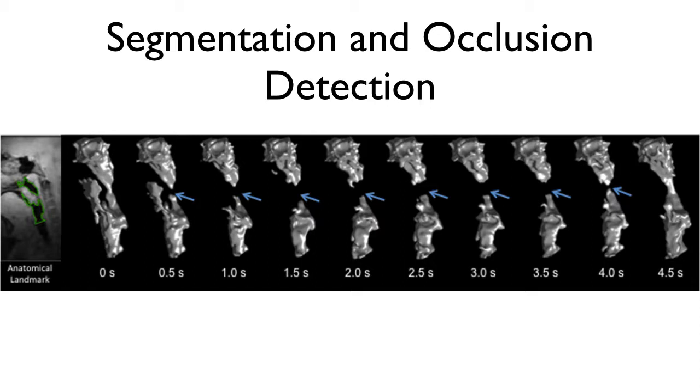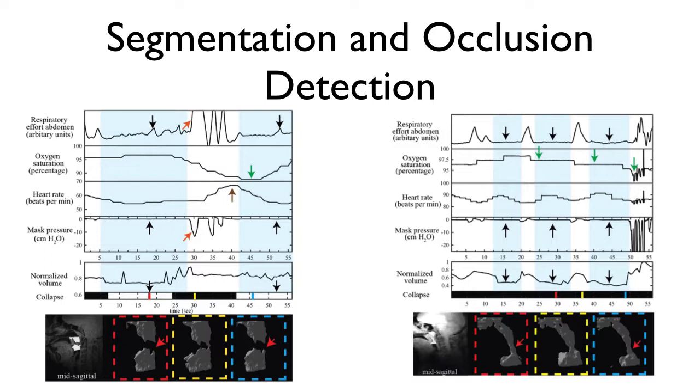Initially, our patent airway looks a little bit like what's shown on the far left, and this technique could be used to identify occlusions when they happen, because during an occlusion, the two ends of the segmented volume do not connect. So if there's multiple distinct volumes, we consider that to be an occlusion. This we integrated into our interface, and now we're able to identify such events.